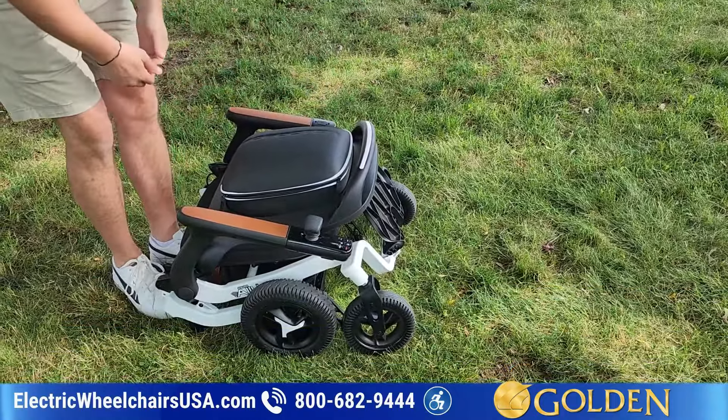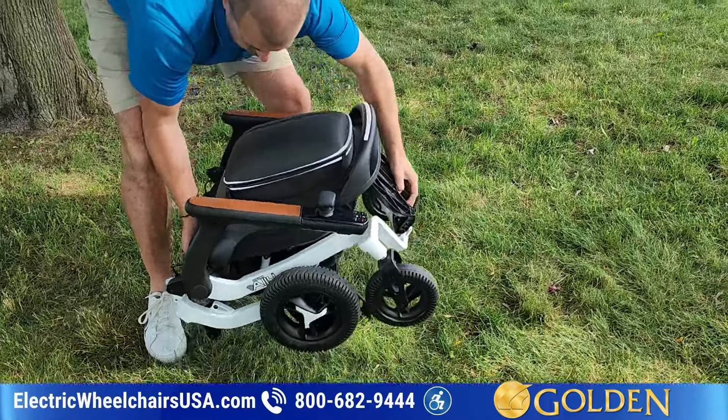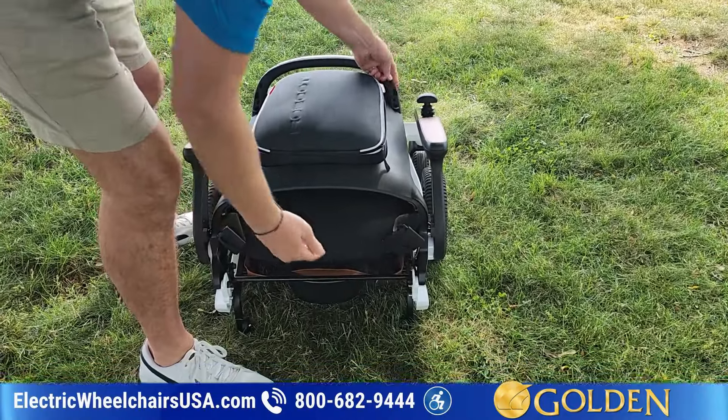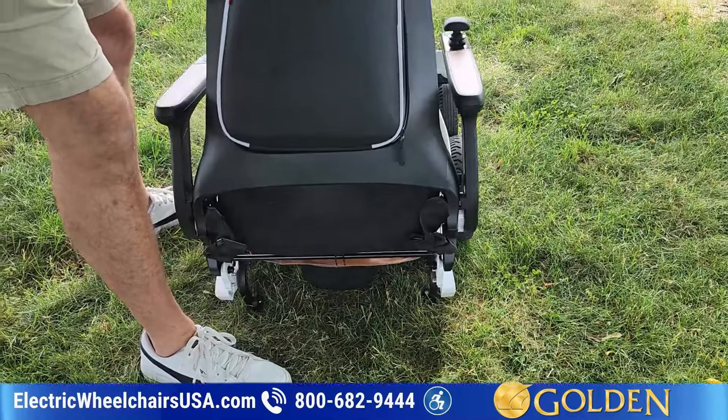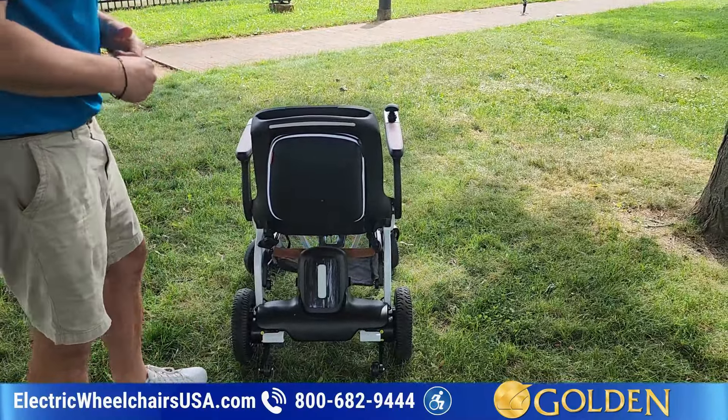It folds a little differently than most other folding power wheelchairs on the market. Now you can lift it and put it in the back of your vehicle. In order to unfold, you can put your foot here or you can just lift it up like this — and that's how you would unfold it. It takes a little bit of getting used to.